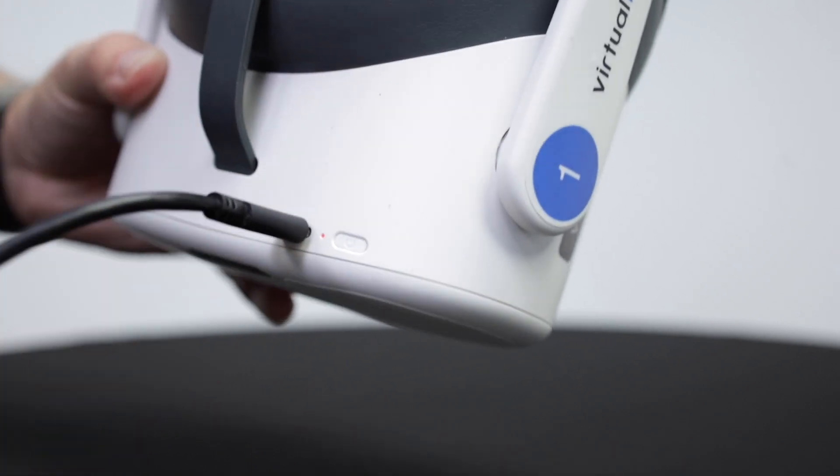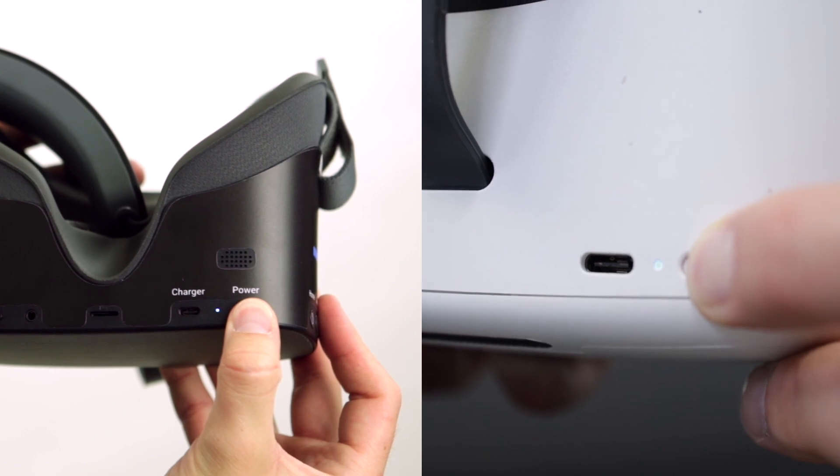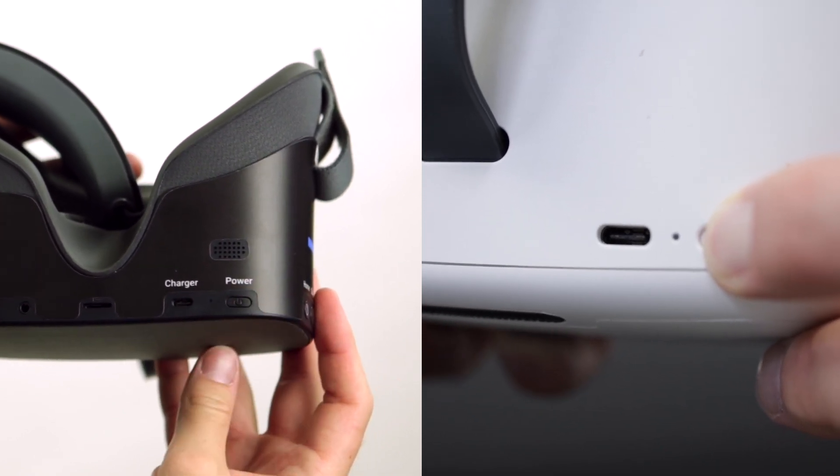Both ports are near the power button. If you don't plug the charging cable all the way into the device, it might charge too slowly or not at all. Second, we recommend that all practices charge their devices overnight. You should also charge your device over the weekend so that you're ready to start testing on Monday morning. Before charging overnight, turn your device all the way off by holding the power button down for five seconds.